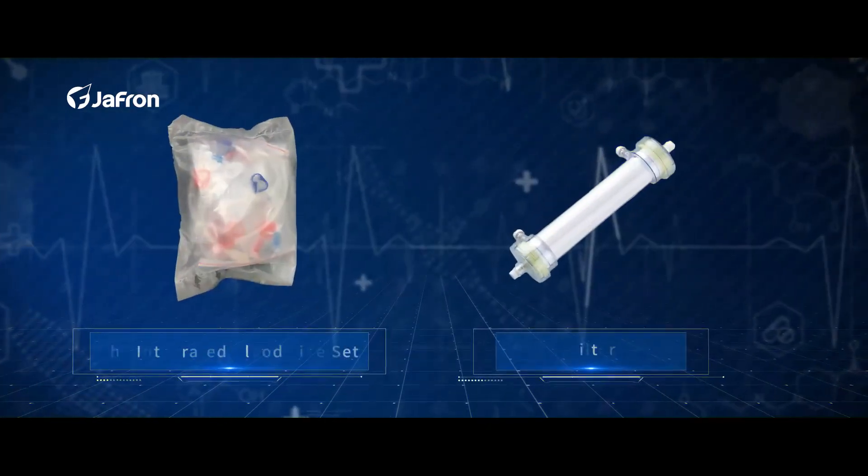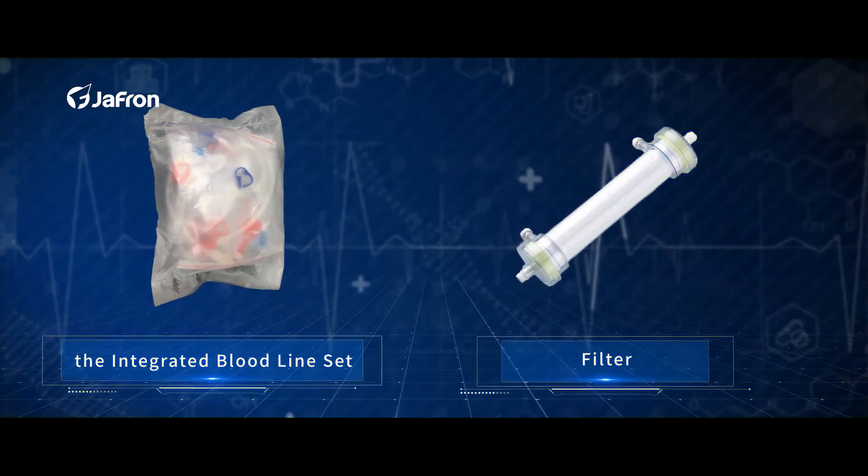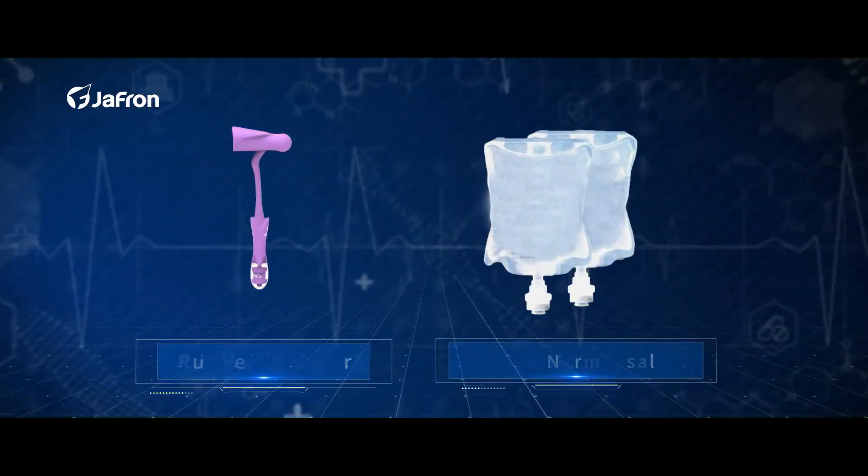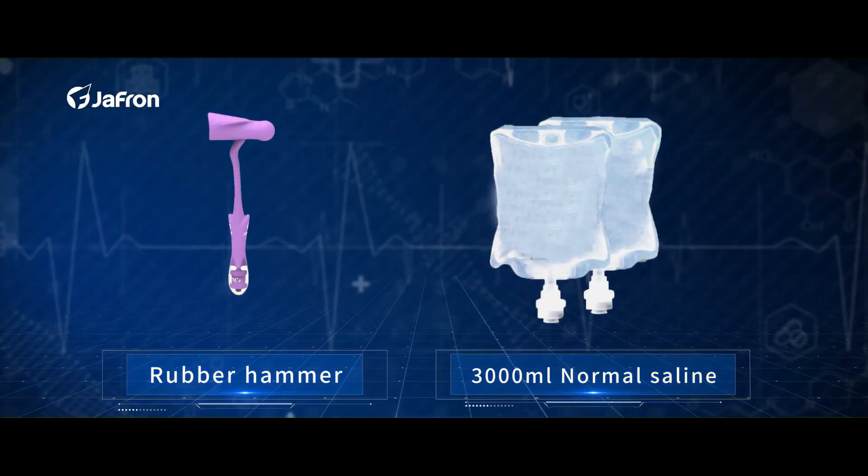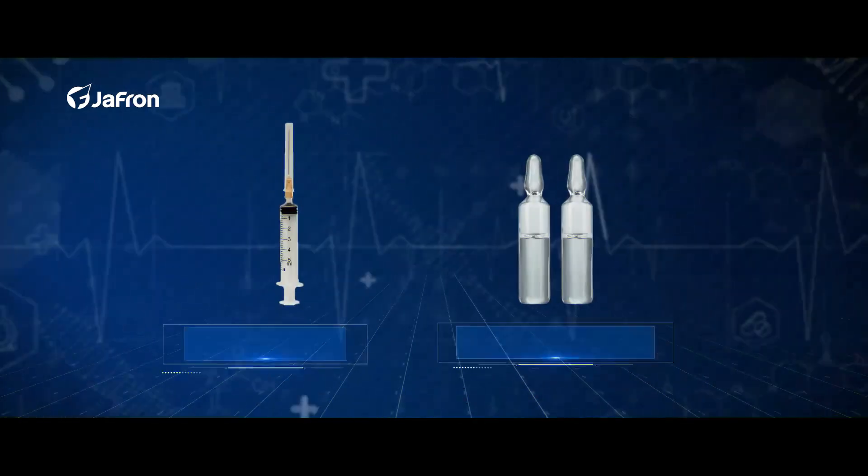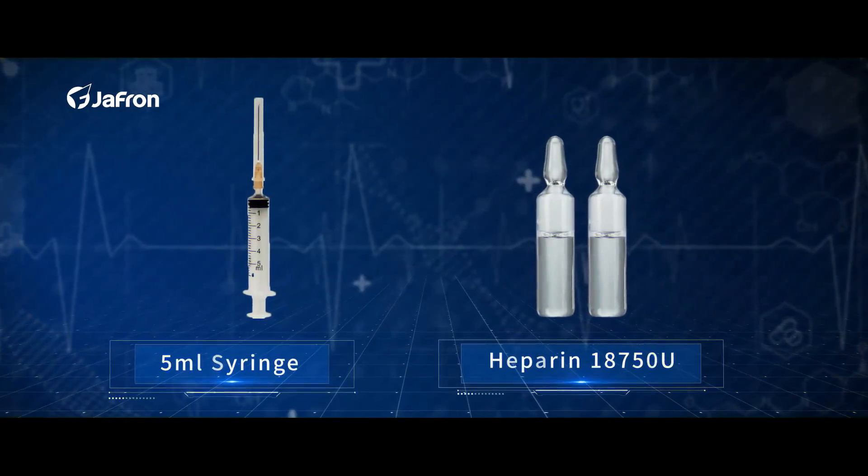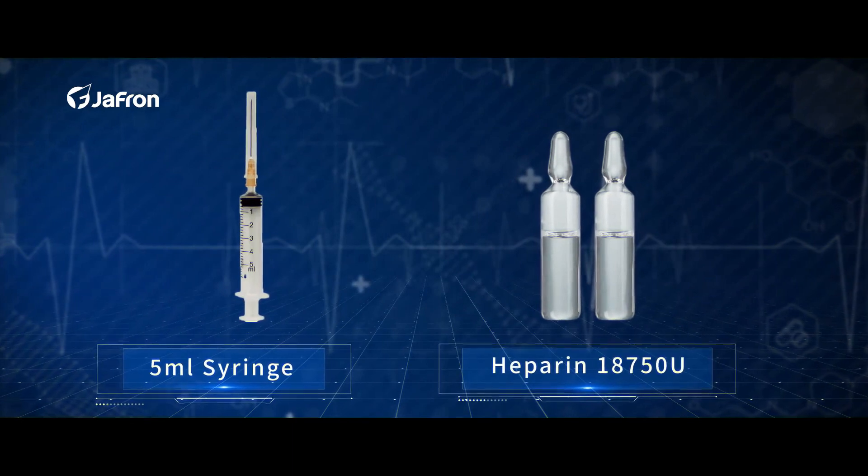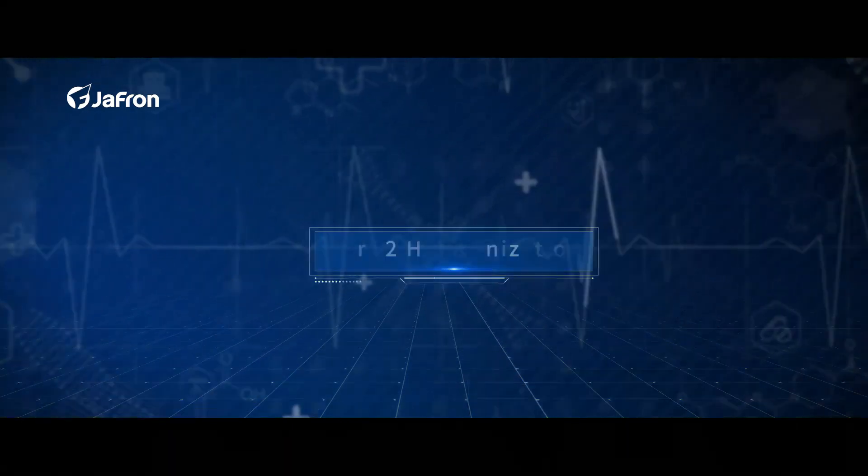The Integrated Bloodline Set, Filter, Rubber Hammer, 3000ml Normal Saline, 5ml Syringe, Heparin 18,750 units.